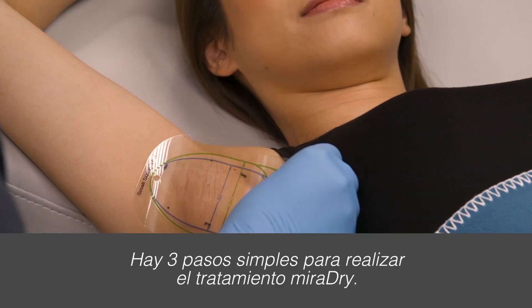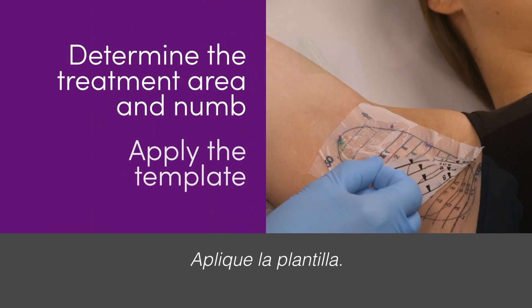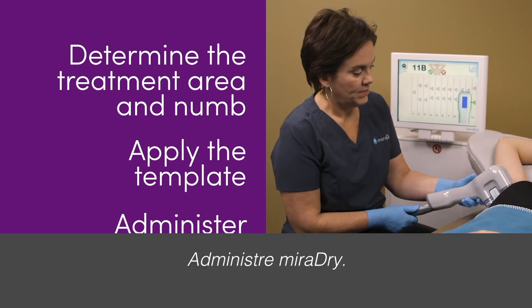There are three simple steps to perform the Miradry treatment. Step 1: Determine the treatment area and numb. Step 2: Apply the template. Step 3: Administer Miradry.